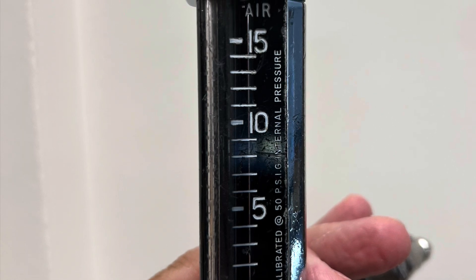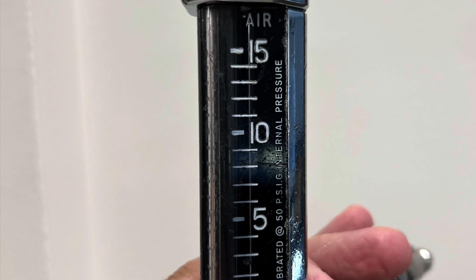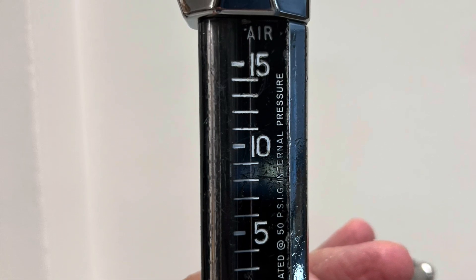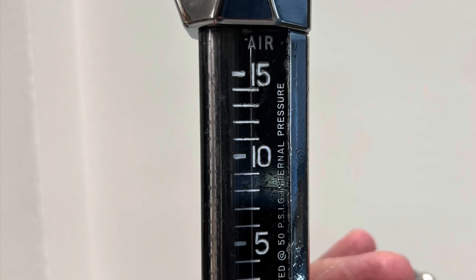If you look at the right side of this Thorpe tube, you can see the words that this Thorpe tube was calibrated at 50 psig pressure. If you see those words, then you know that this Thorpe tube is a back pressure compensated Thorpe tube.